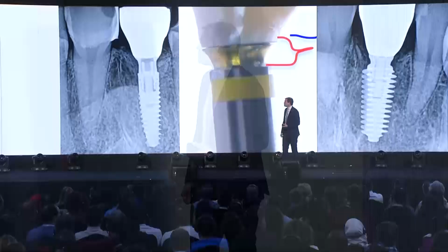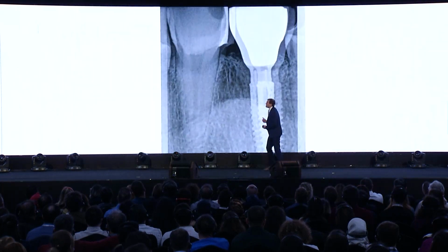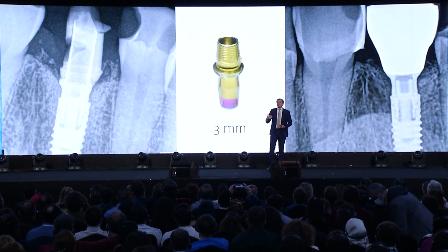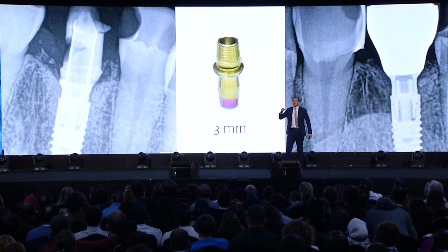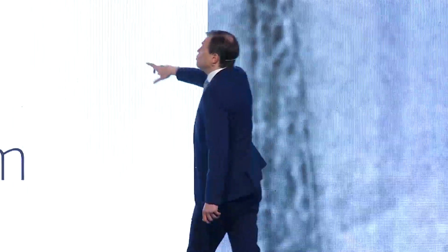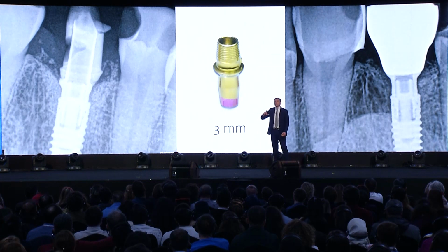And here I want to show again the research which we just published this week, which we did with NucleOSS. It's, I think, a very big step in order to understand factors for crestal bone stability. What is usually the problem? The problem is that we do not know the exact height of the titanium base, which guarantees us crestal bone stability.